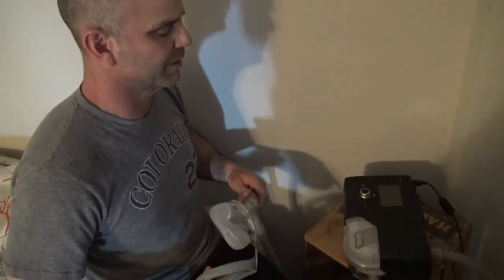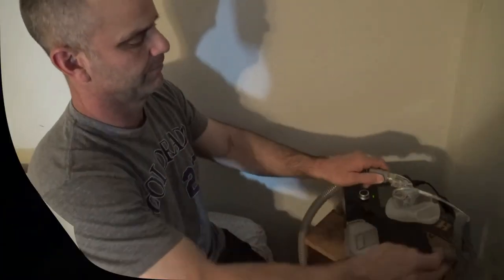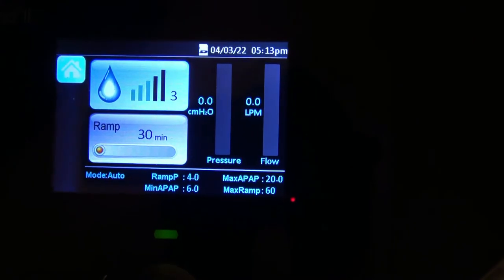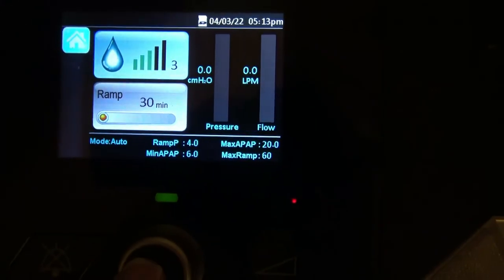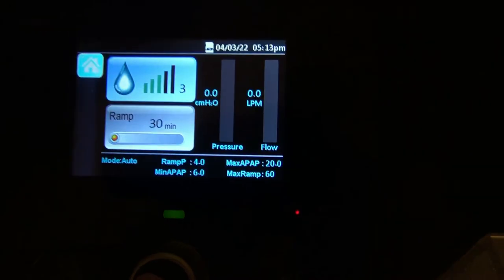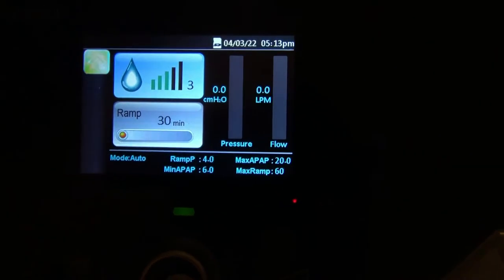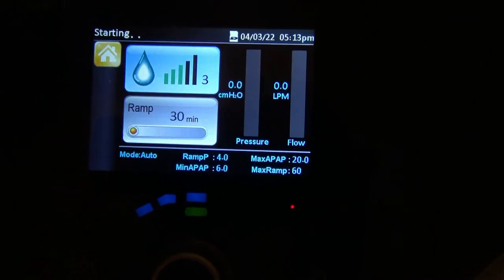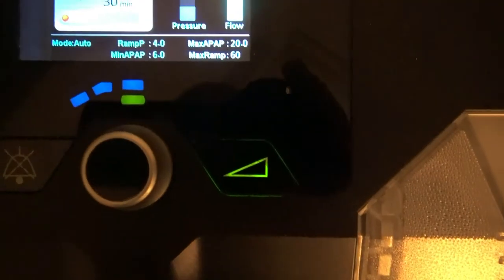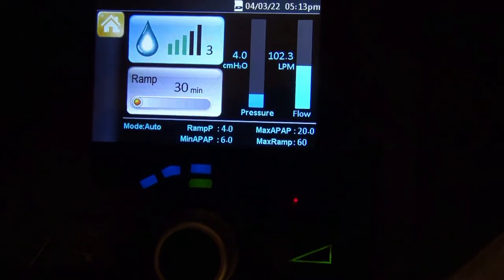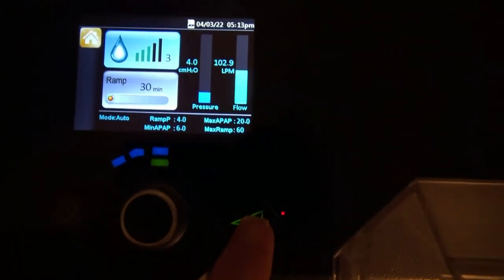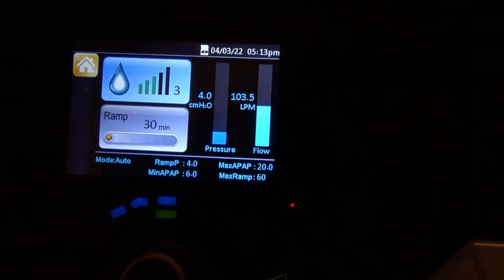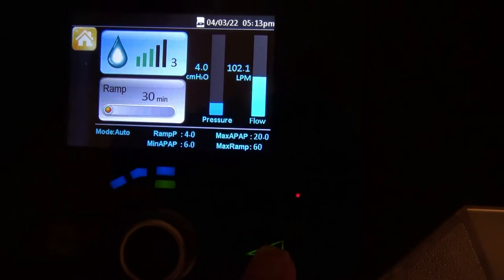I'll let my wife talk about cleaning it. I just wanted to say real quick, I did forget to explain the ramp button. I do believe I already turned it on. All you have to do is turn it on and turn it on again and it'll start. You can see the ramp button lights up, so it automatically turns the ramp on and it'll go to full power after 30 minutes.